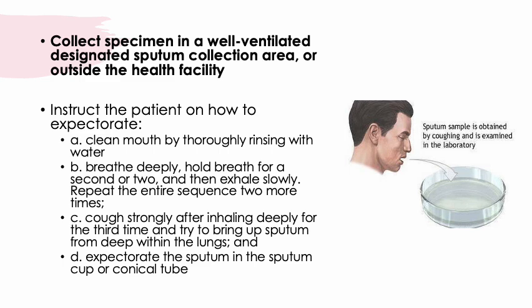As you instruct the patient, these are the specific instructions before and within the collection. You instruct the patient on how to expectorate. First, before the patient expectorates, the patient needs to clean his or her mouth by thoroughly rinsing with water. Do not use mouthwashes. You just rinse your mouth with water, to avoid adding food particles in the sample.